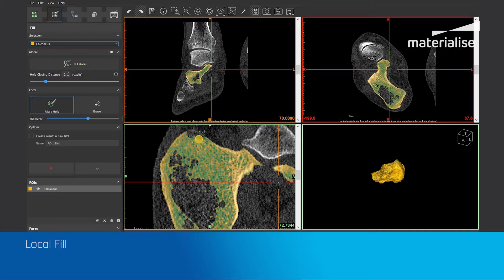The local fill is hidden by default so you can focus first on the global fill, because the global fill will do it automatically for you. The local fill can be used afterwards, or can also be used from the start if you want to have more control over what needs to be filled up.